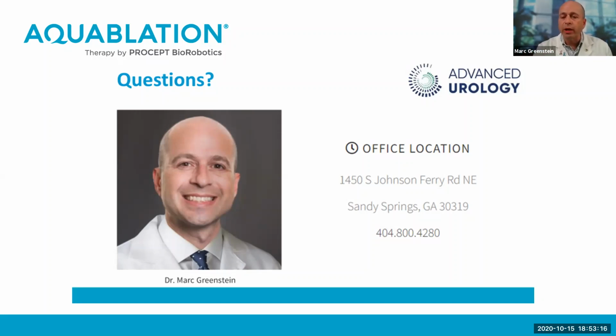Erections. What will my erections be like? Well, the other nice thing about this technology, like some other technologies, is that it should not affect the nerves that head to the penis to help you get an erection. Those nerves are underneath the prostate, and because there's no heat or energy involved, those nerves should be spared. So the erection should be fine.